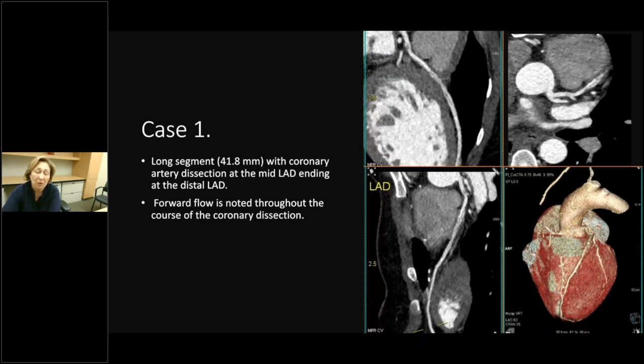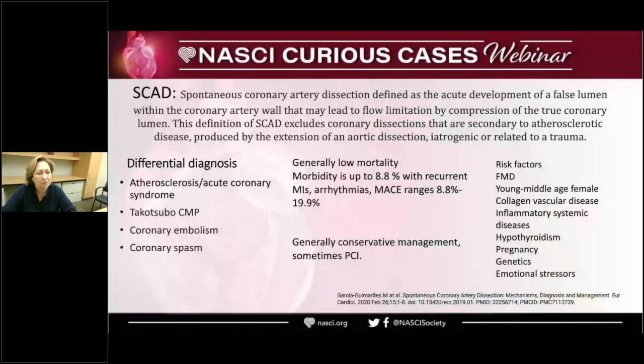So she came already with the diagnosis because she had some workup done at an outside institution. All I have here at Texas Heart is that we did this coronary CTA. To the best of my knowledge, no, she doesn't, and we did look into everything.